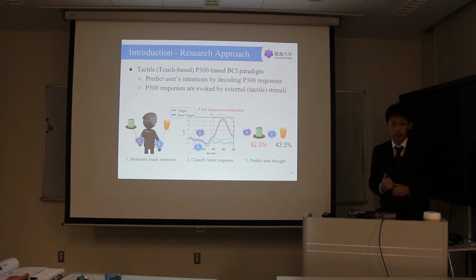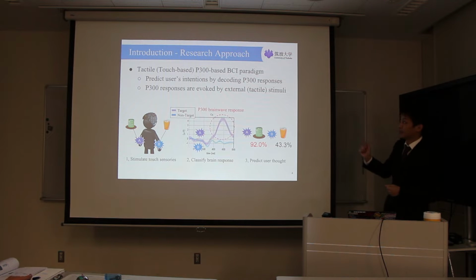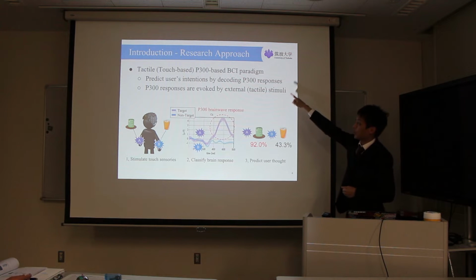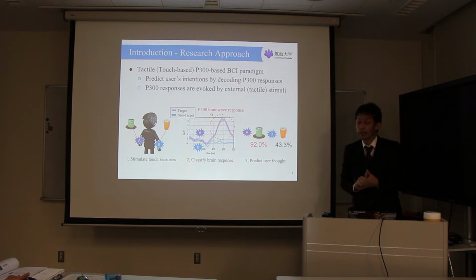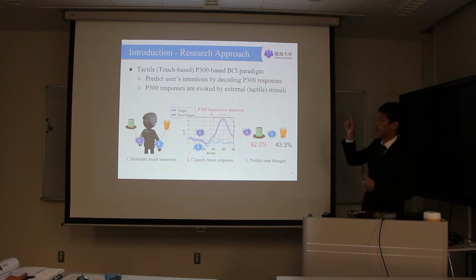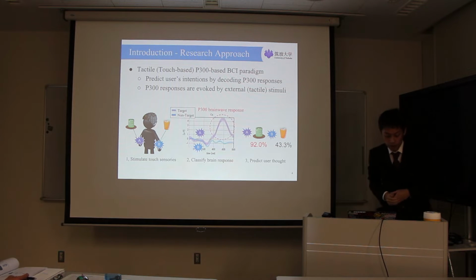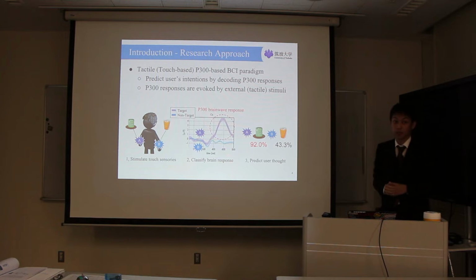My research approach in the BCI study is a tactile P300-based BCI paradigm. The main purpose of a P300-based BCI paradigm is to find P300 brainwave responses to external stimuli, like visual or auditory stimuli. But in this project, we have applied a tactile, touch, vibration stimulus to this BCI paradigm to evoke these brainwave responses.